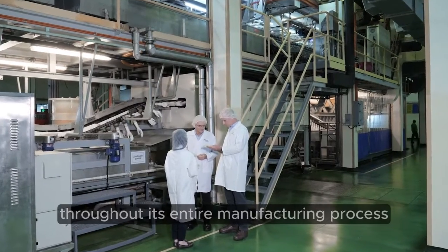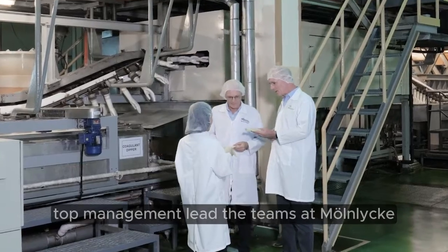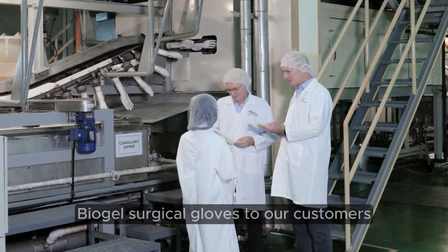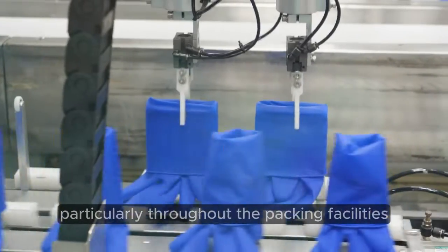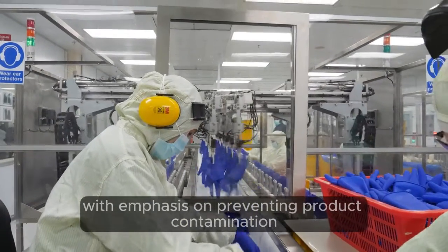With quality assurance throughout its entire manufacturing process, top management lead the teams at Mölnlycke in delivering the highest quality Biogel surgical gloves to our customers. Strict hygiene standards are always maintained, particularly throughout the packing facilities, with emphasis on preventing product contamination.